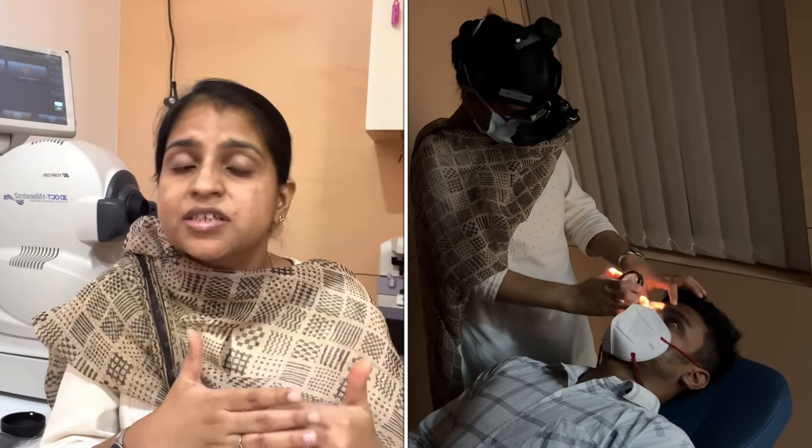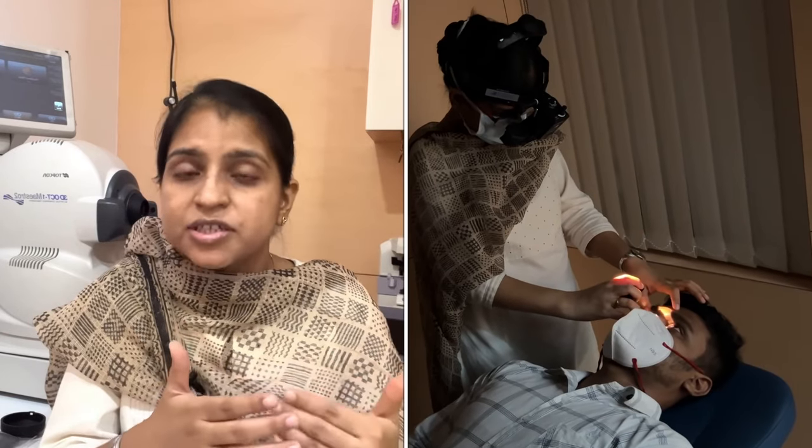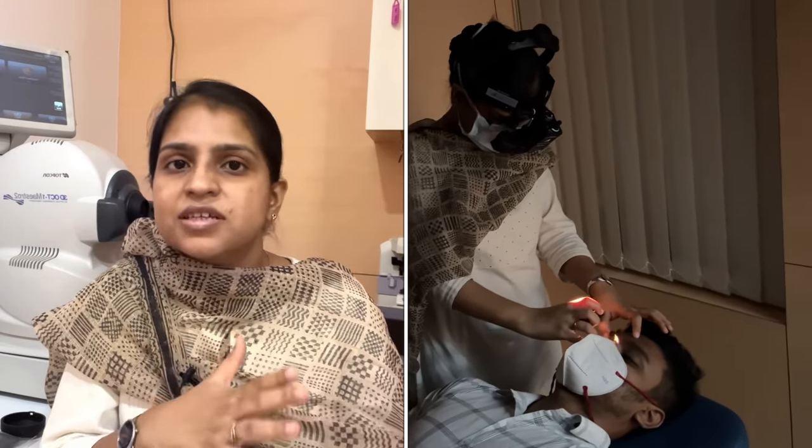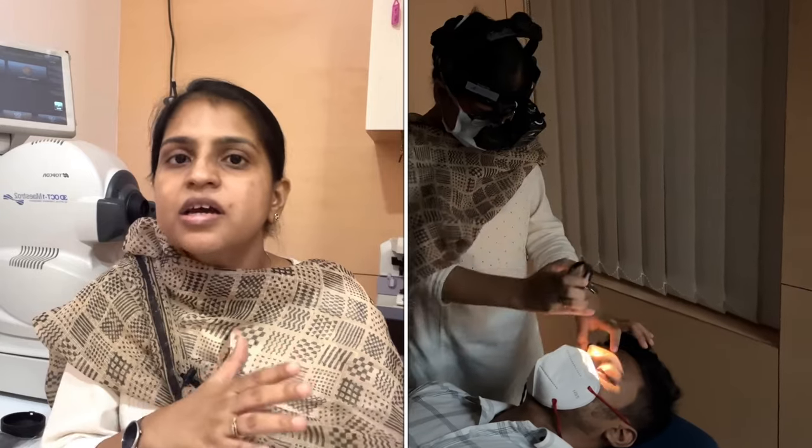Now we have to look at the back of the eye — we call it the retina test or fundus test. We use this machine to look through the lens. This is the fundus test.